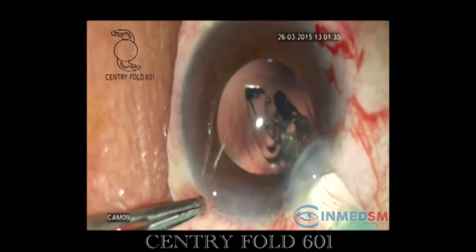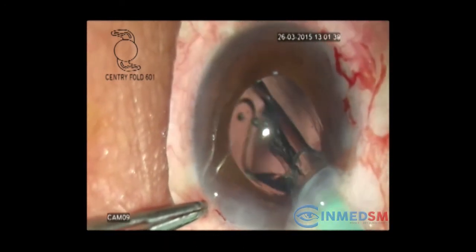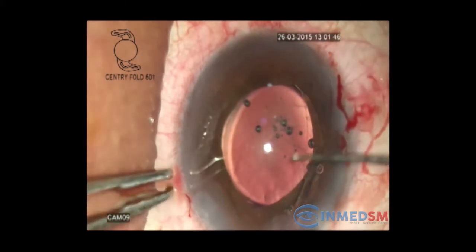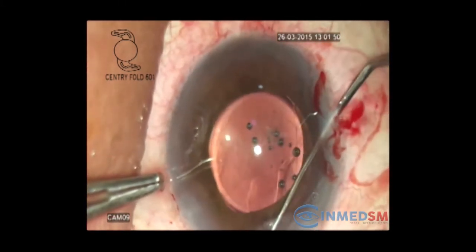The leading haptic is guided into the capsular bag during the implantation process. The trailing haptic is then dialed into the capsular bag with the help of an IOL dialer.